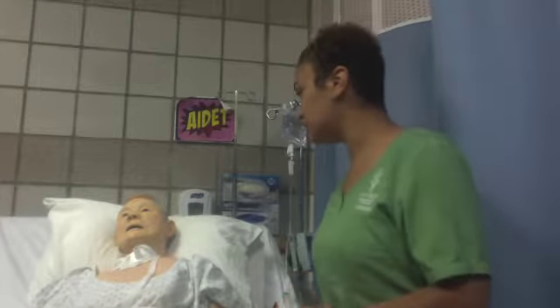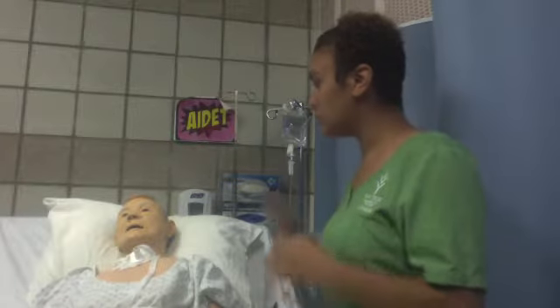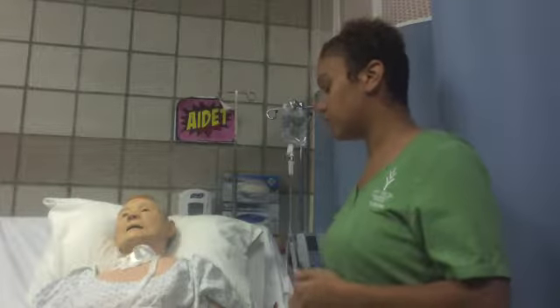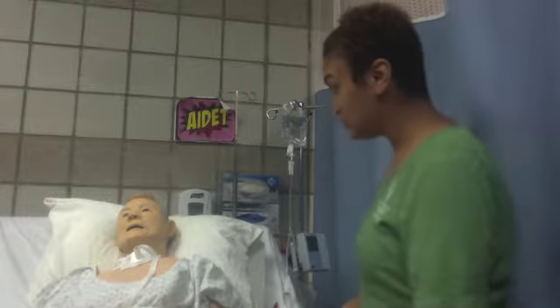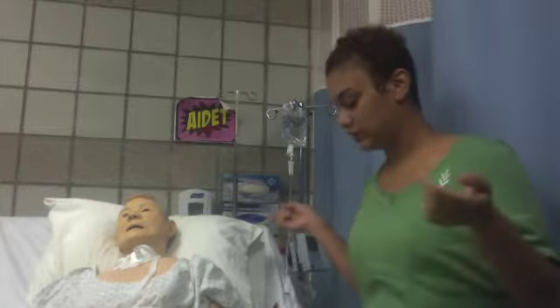So we're going to be doing a blood transfusion because you've had a GI bleed and you've lost some blood. So we just want to make sure that you remain healthy, so we will be infusing some blood into you, okay? So that'll be the process that we are performing right now. Do you have any questions? No? Okay. So then we are going to go ahead and already assemble.